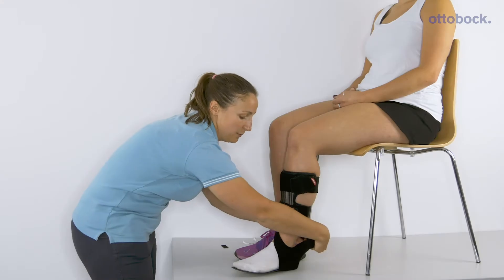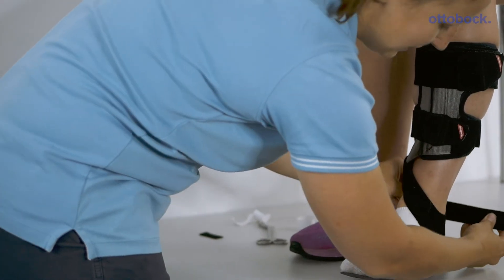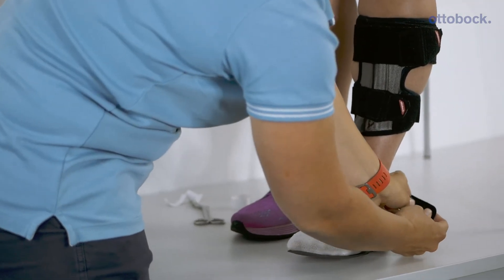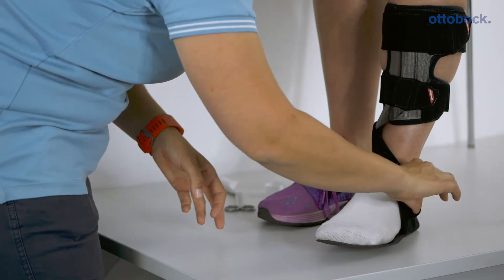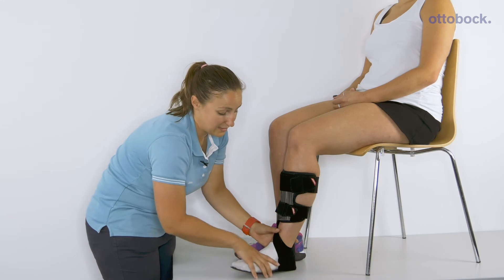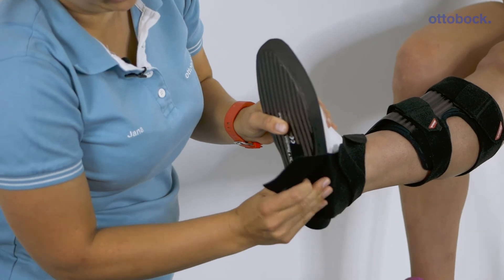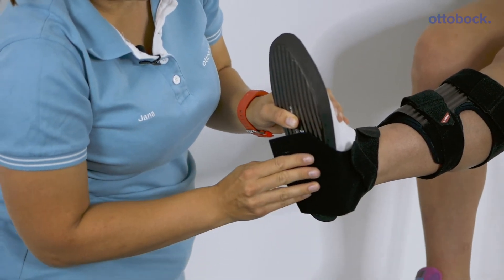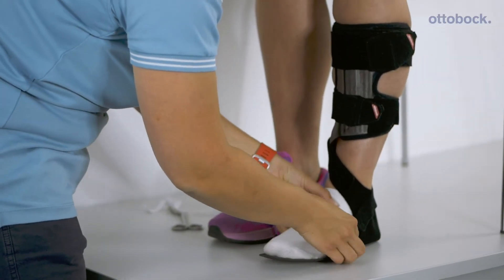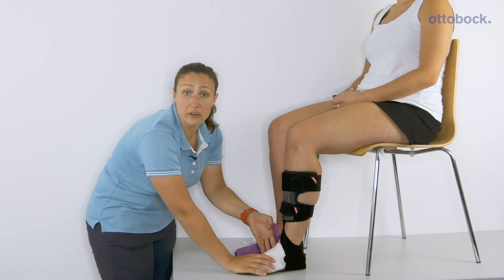With the posterior strap, go behind the Achilles tendon, around the medial strut, and again attach it in place with one of your double-sided velcros. These can be trimmed to length. If it's not fitting particularly well, the best thing to do is lift up from underneath and reposition it so that you've got a good fit, and that section can be adjusted. This will then give some supination resistance.